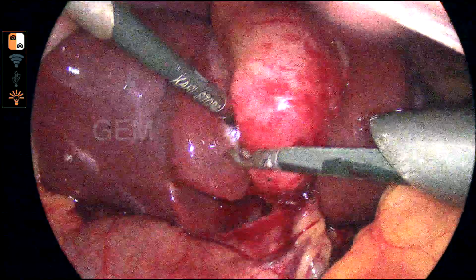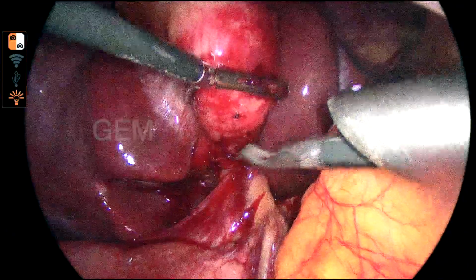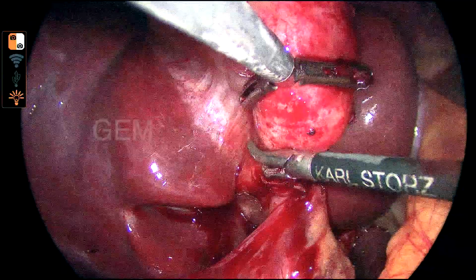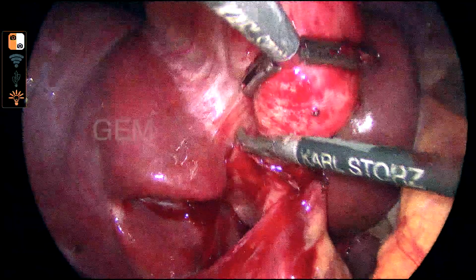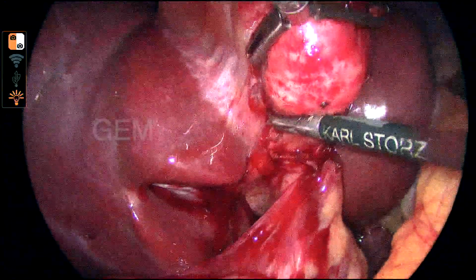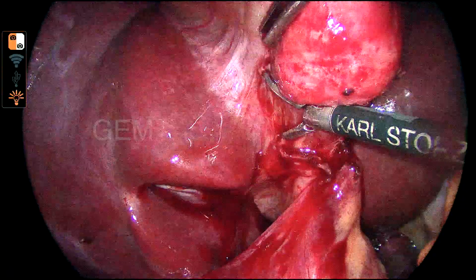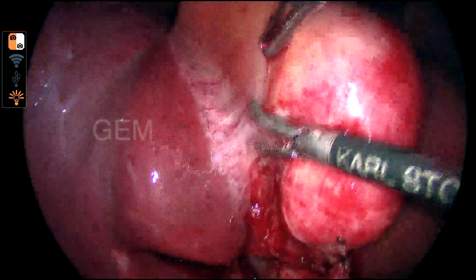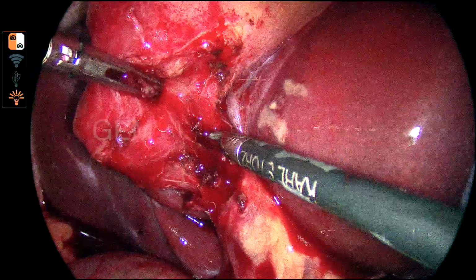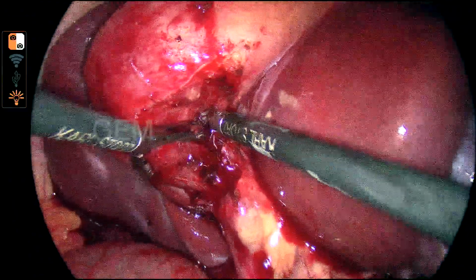Meanwhile, I am trying to do the posterior peritoneal incision, and I want to see the critical view of safety. The posterior peritoneum, you can see how much the peritoneum got stretched, and a lot of small vessels are there. Anyway, it is clear posteriorly, and there is no other tubular structure seen there.